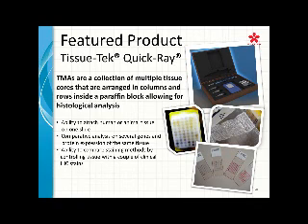And that just kind of goes off of any type of airborne particles that can be put on. I mean, you shed epithelial cells that can be picked up by immunohistochemistry stains, and any kind of just debris that may attach to that slide can actually cause immunohistochemical stains to pick up on that, and can cause really non-specific staining in different areas that you're just not really too sure what that is.